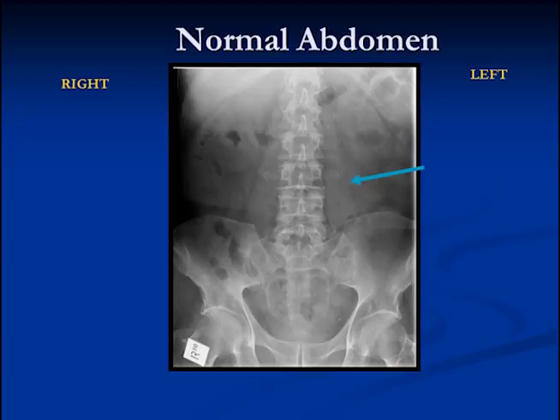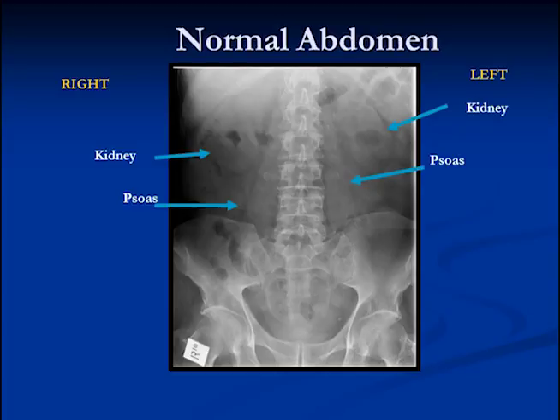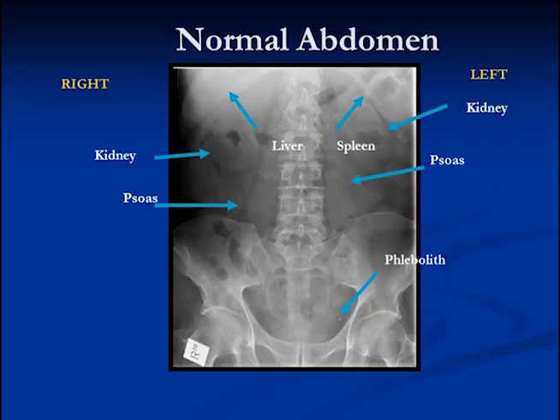The first structure you should always look for is the psoas muscle — there it is on that side, and here on the other side, forming a triangular shape around the lumbar spine. You can sort of see an outline of a bean in the upper quadrant — this is the kidney — and here's the kidney on the other side. There's also a line between white and black over the kidney — this is the edge of the liver. A similar line on the other side shows the edge of the spleen. This little calcified density in the pelvis is a phlebolith, which are little stones that form in veins — they don't mean anything. The soft tissue density within the pelvis is the bladder.